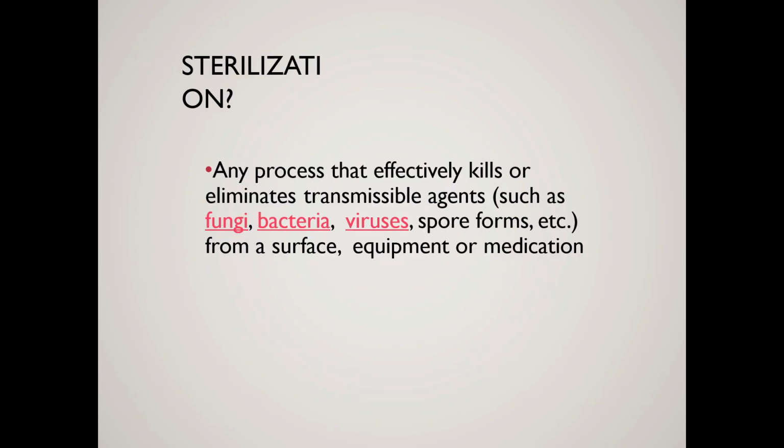What is sterilization? Any process that effectively kills or eliminates transmissible agents such as fungi, bacteria, viruses, and spores from a surface, equipment, or medication. This is what sterilization means.